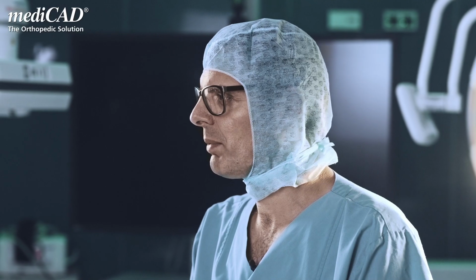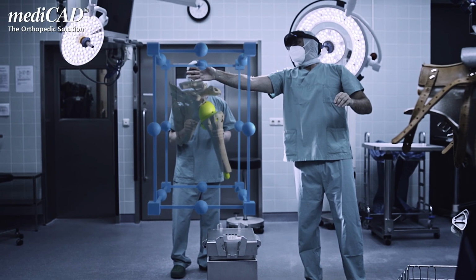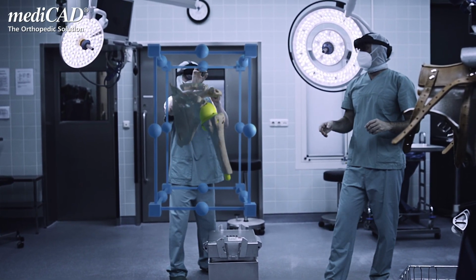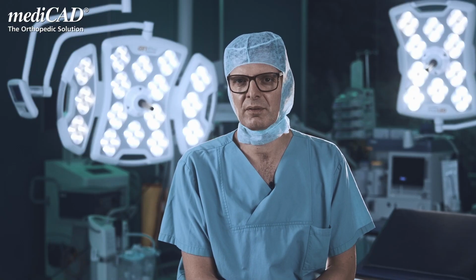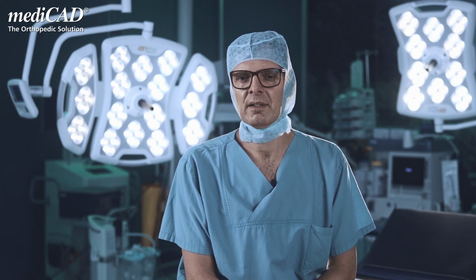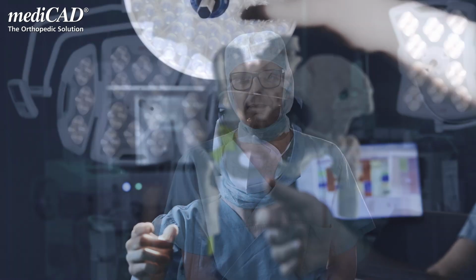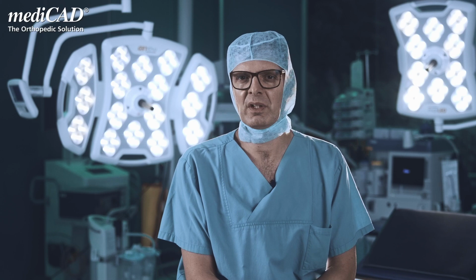There are many operations which are not that frequent, which one always struggles to integrate into the training. The HoloLens streaming function, which enables recording as well as saving, gives me the opportunity to demonstrate to young doctors and explain the experiences directly from the operating theater or afterwards. Thanks to the recording, complex cases can also be discussed afterwards.